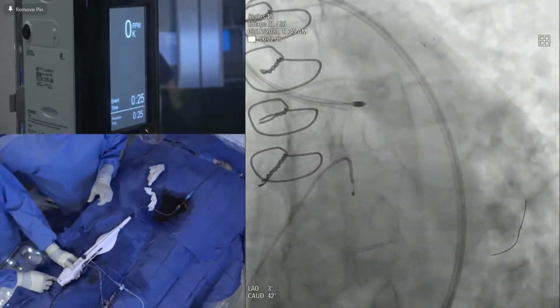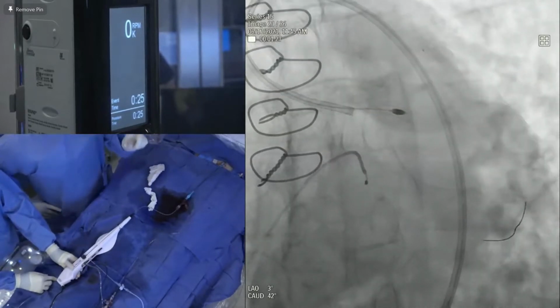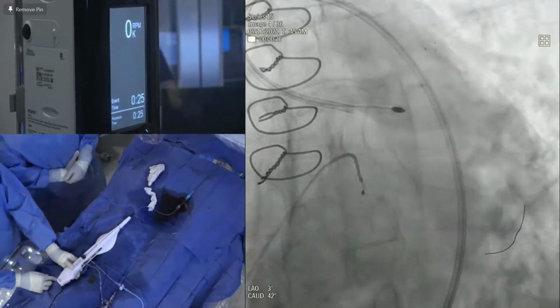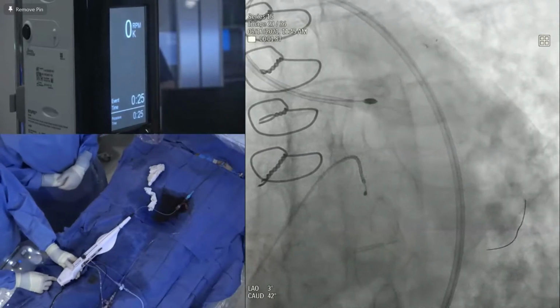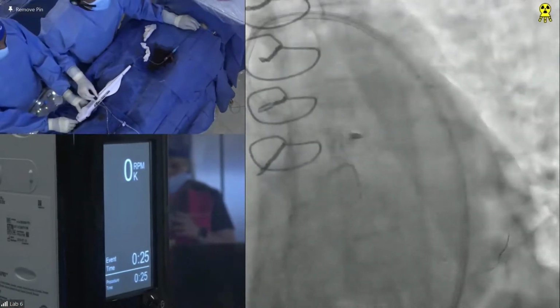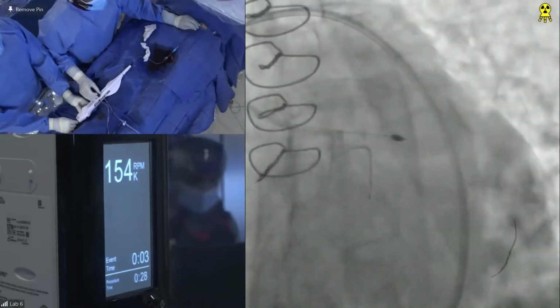The CVT will tell us that it's more than 20 seconds. We are looking at the blood pressure. Nurses automatically give neosynephrine once it goes down to less than 100 systolic pressure; here we need a little push. And they should be showing the hemodynamics on one side also. What's the RPM you're choosing for these? Yeah, 150, right now 150. If we need to go further, we'll go further.